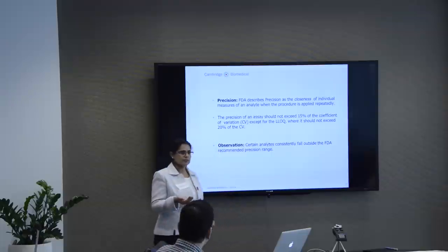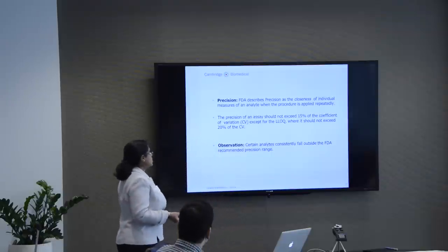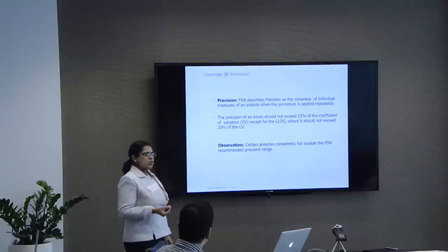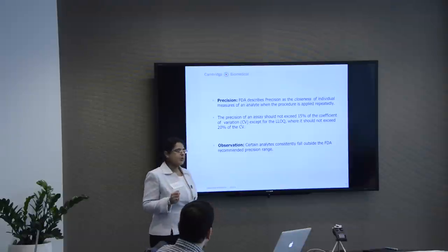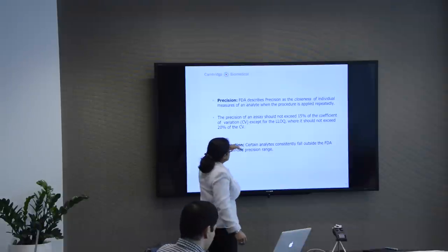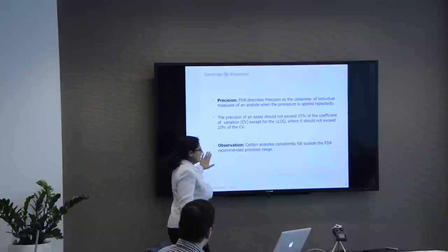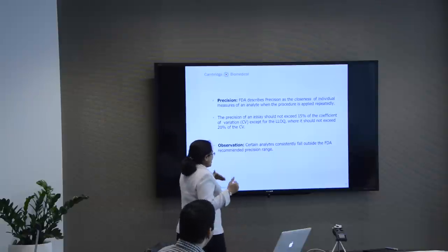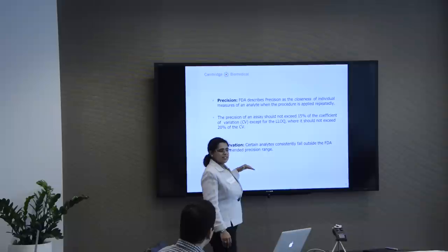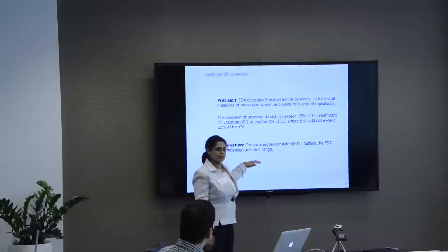Precision. FDA describes precision as the closeness of individual measures of an analyte when the procedure is applied repeatedly. And that precision has to be in between 15 to 20% CV. Does it work? No. There are certain analytes that consistently fall outside this recommended precision range of 15 to 20%.